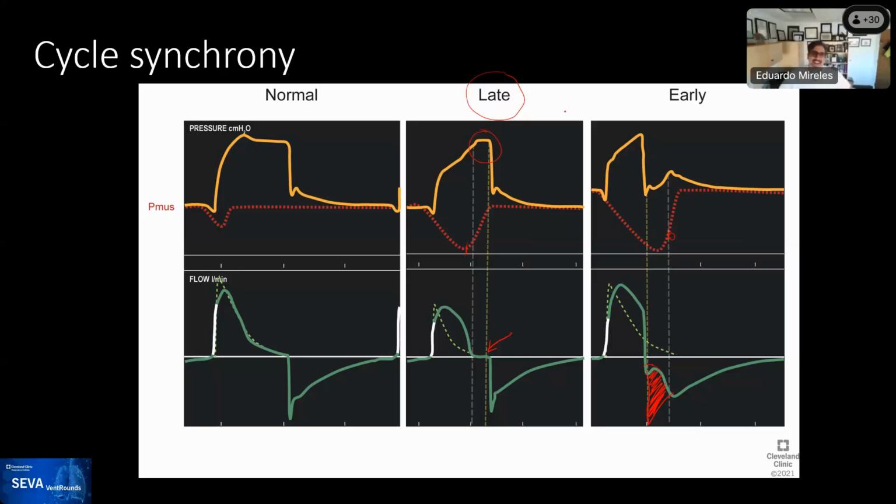Yes, I love it. Thank you, Miguel. So one of the questions, and Miguel has it here, is: in strict terms, as he puts it, is the first example labeled as normal also late cycle, but clinically there is no attempt from the patient to exhale? So am I right? And yes, you are right.